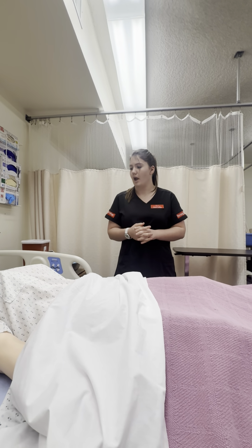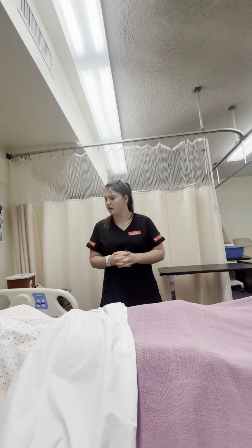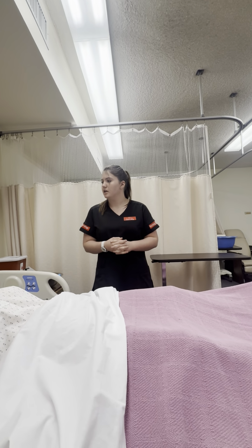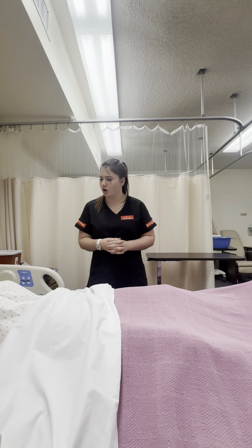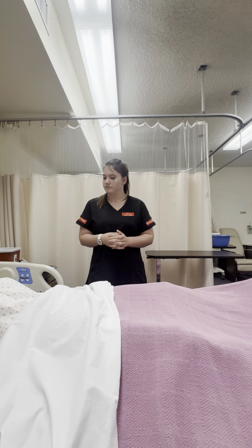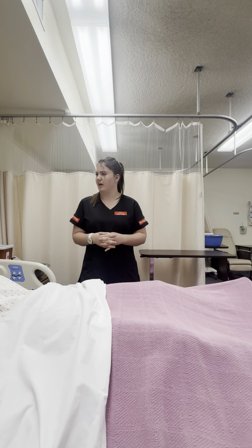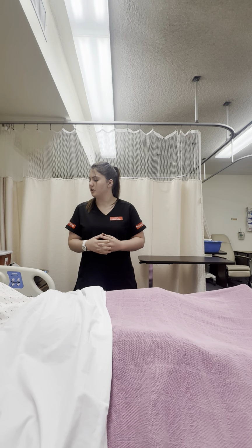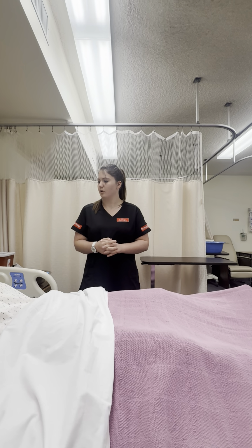No. Okay. Have you experienced any burning, itching in your genital region at all? No. No? Okay. Have you noticed any signs of infection, any irregular discharge, or anything like that? No, everything is fine. Okay. In your abdomen, have you experienced, maybe felt any sort of retention or fullness, maybe in your abdomen? No, I mean, the catheter is really working. Okay, it's been working out well for you.